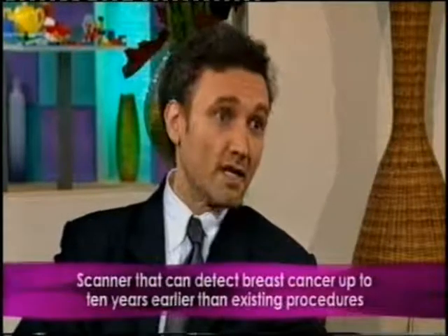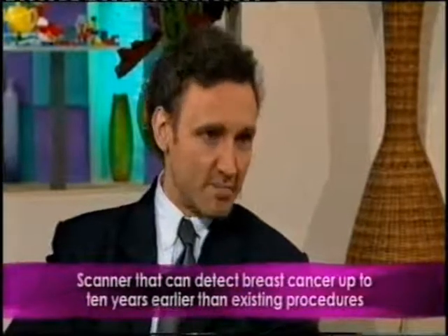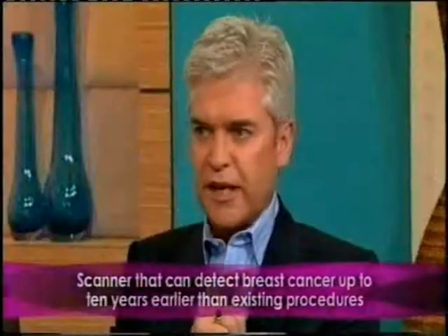And this can detect possible breast cancer, is this right, up to 10 years prior to the technology we have available now? That's correct, 6 to 10 years before, because we're not looking for something that has to have a structure or size. We're just looking for increased metabolism or heat or new blood vessel formation, which is a process which occurs around all new tumours. And that's the process which is manifest as heat, which we can detect much earlier than something which has to be grape size.